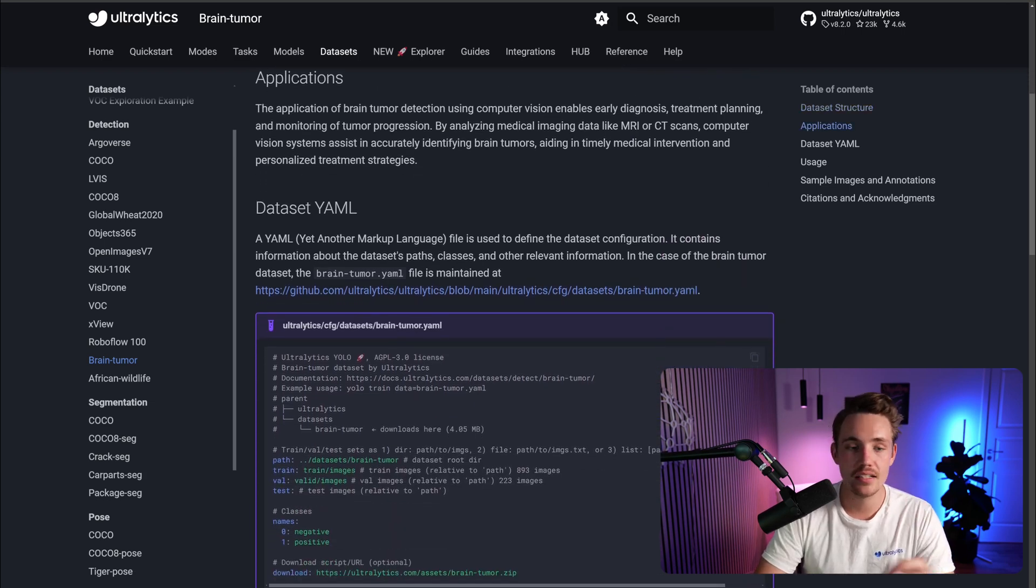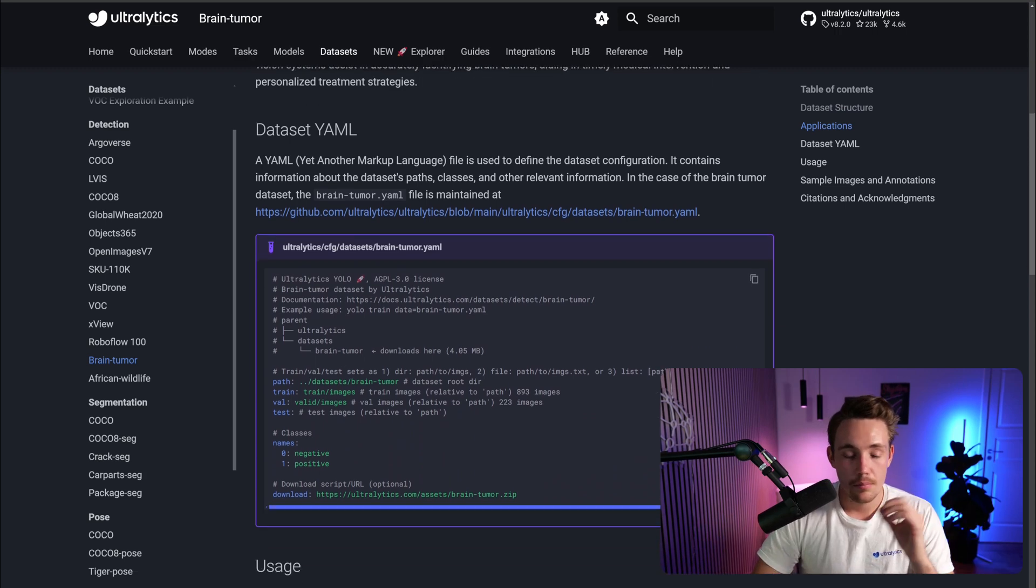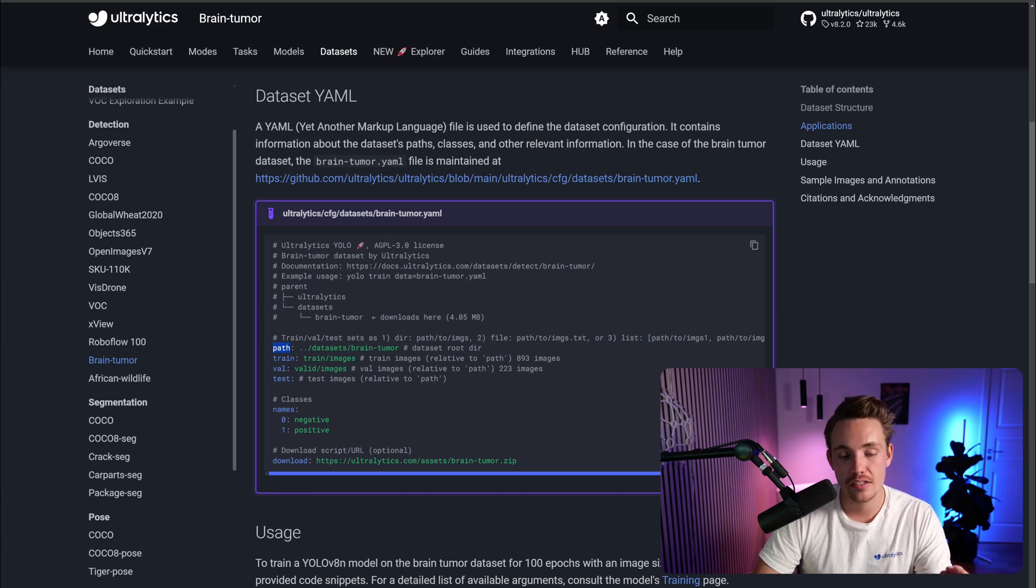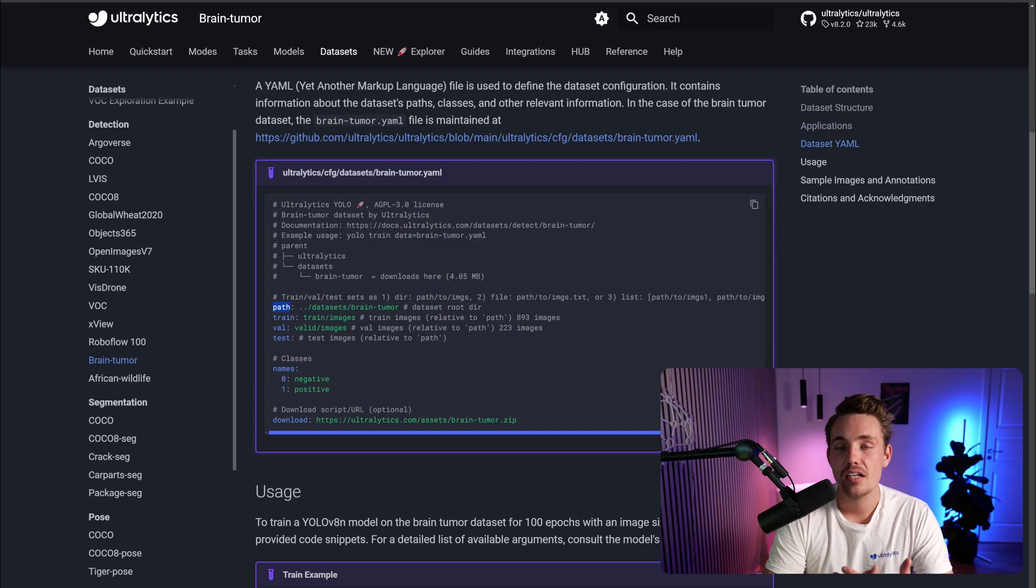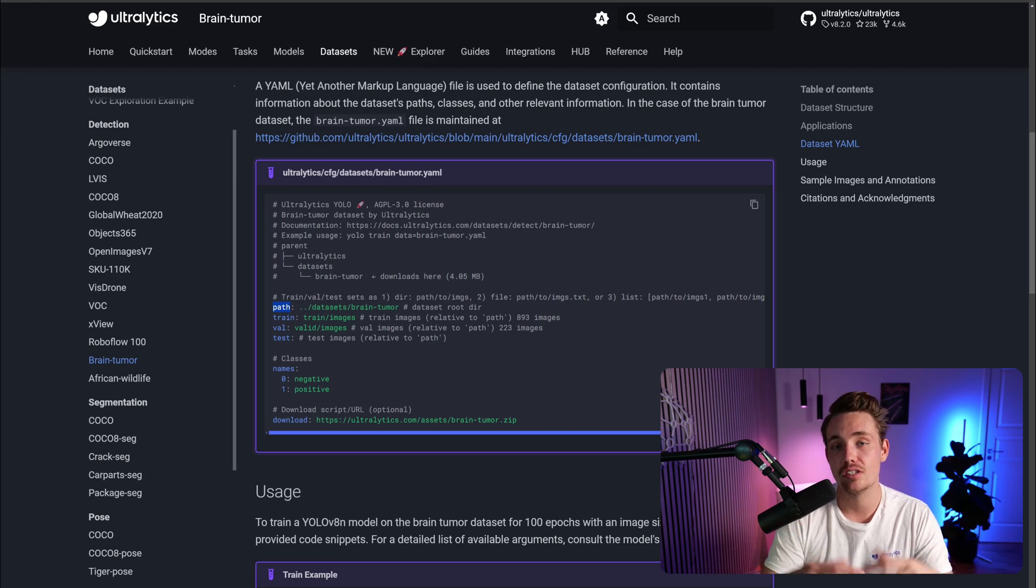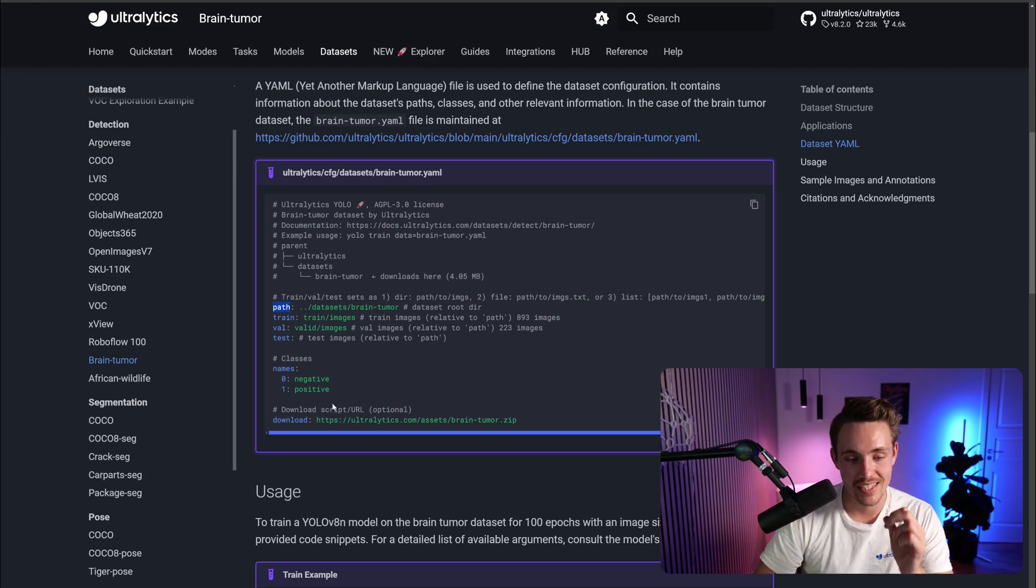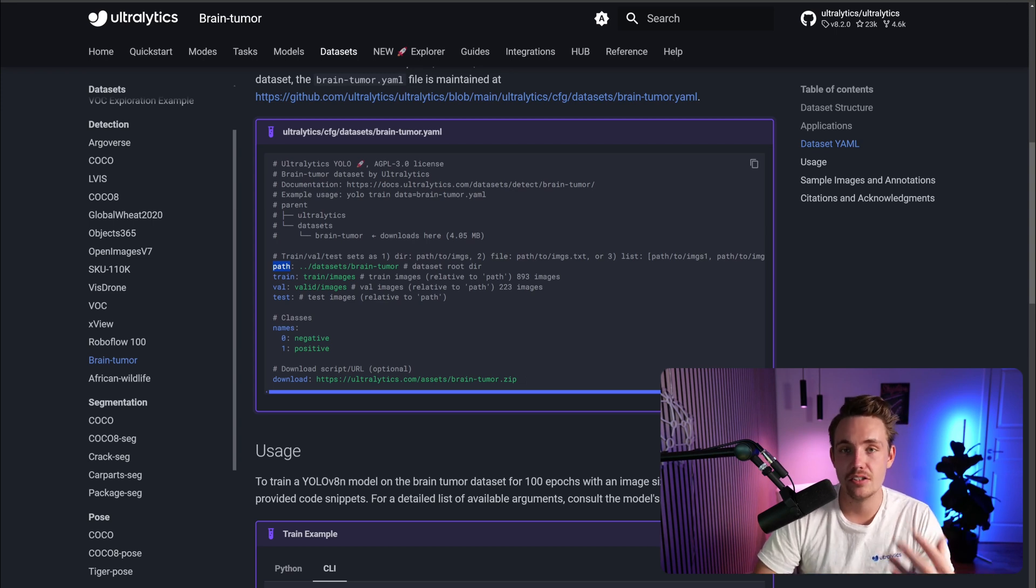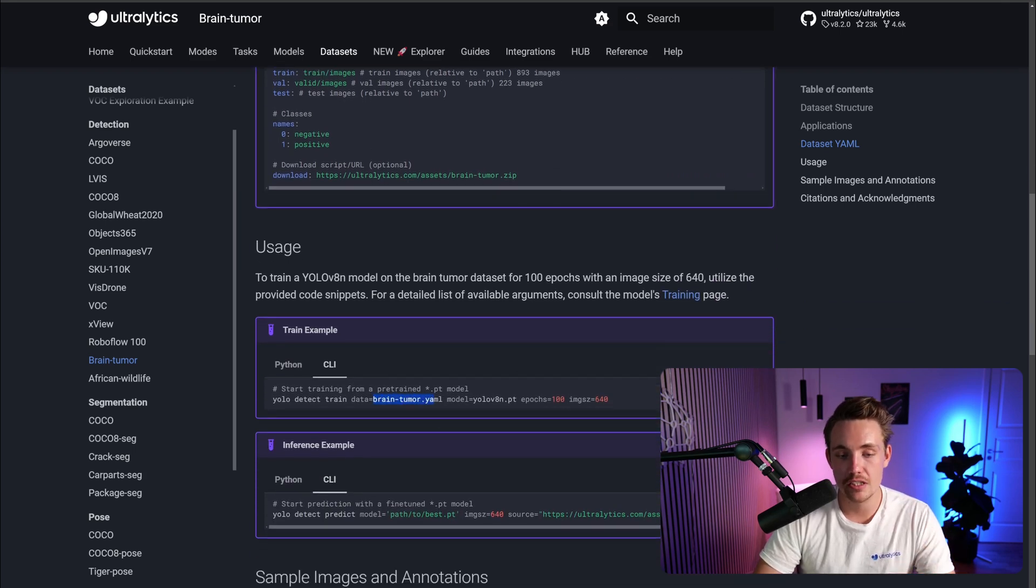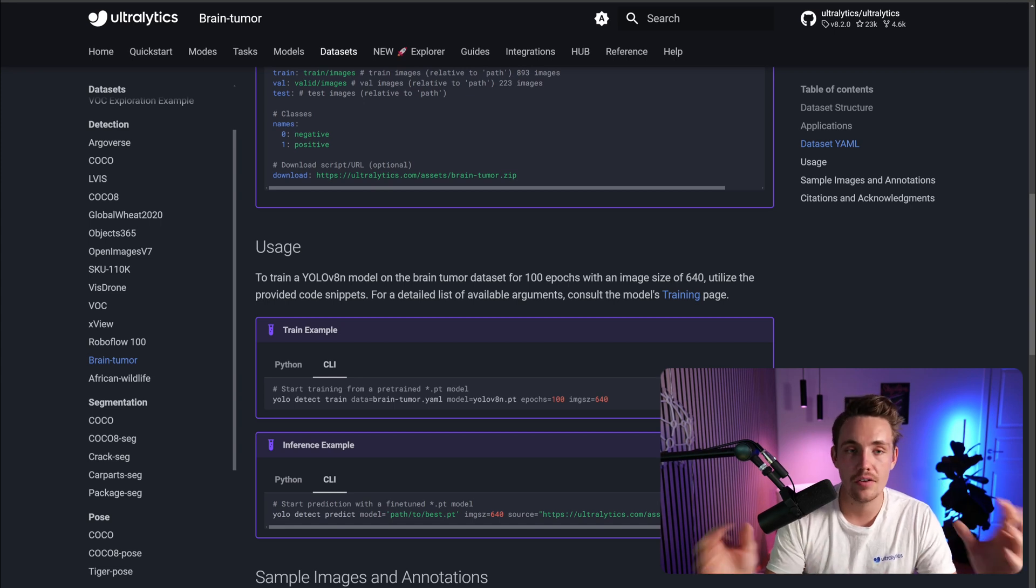This is the dataset YAML file that we need to specify when using the dataset from Ultralytics. We don't have to take care of that. The only thing that we need to specify is the paths - our data set root directory, training dataset, validation dataset, and test dataset. Then we need to specify the different classes. For this dataset, we only have two classes, which is either positive or negative. This is the type or class for the brain tumor that we're going to detect. We also have a download from a URL which downloads a zip file with all the data inside the dataset.